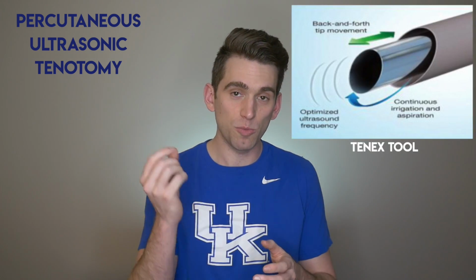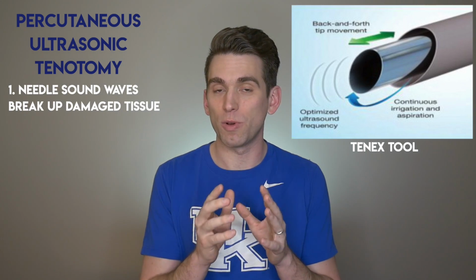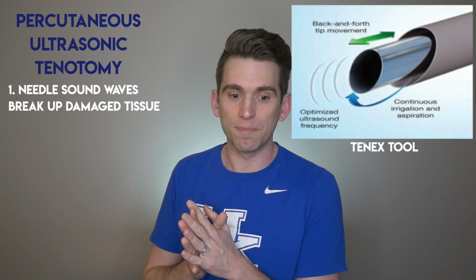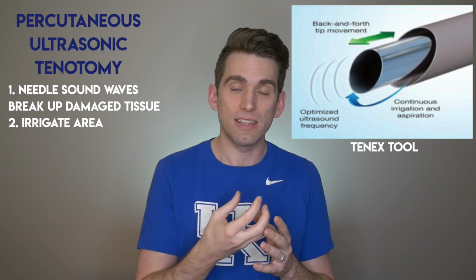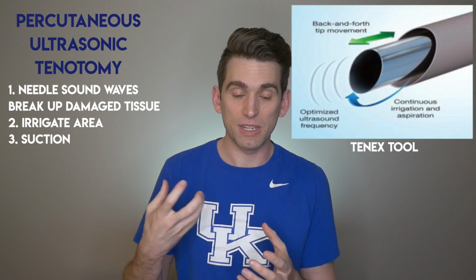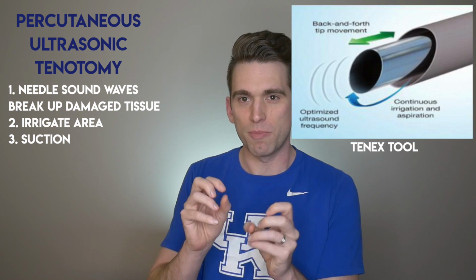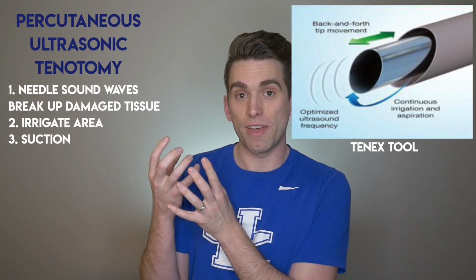There's this awesome tool that some really smart people developed where it's basically a glorified needle, and you put the needle into the tendon and it emits ultrasonic sound waves that help to break up that diseased, damaged tissue inside the tendon. At the same time as it's emitting these sound waves, it's irrigating that area and then has some suction to try to suction out that damaged tissue from the needle. So you put the needle into the disease process in the tendon, you vibrate it with a bunch of sound waves to break up the damaged part, and then you irrigate and suck all that damaged part out.